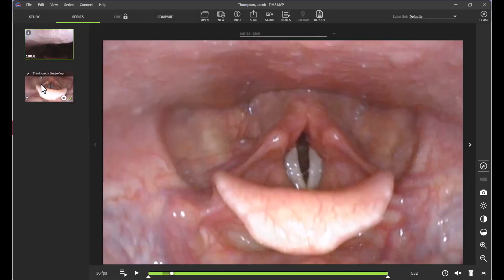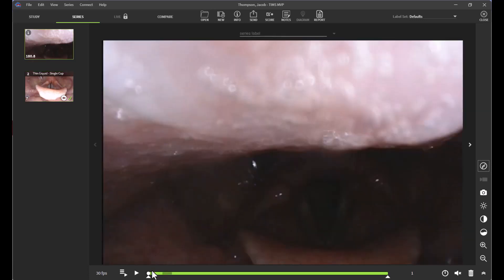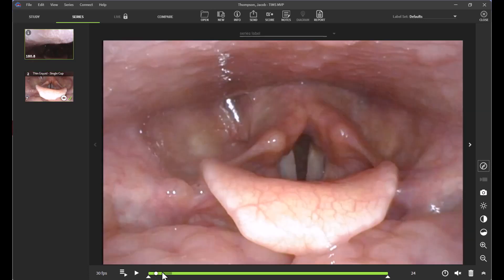Now you may notice that on the left-hand side of the screen, my subclip is isolated here with the label that I just provided. I can go back up to my original study and then create another subclip.